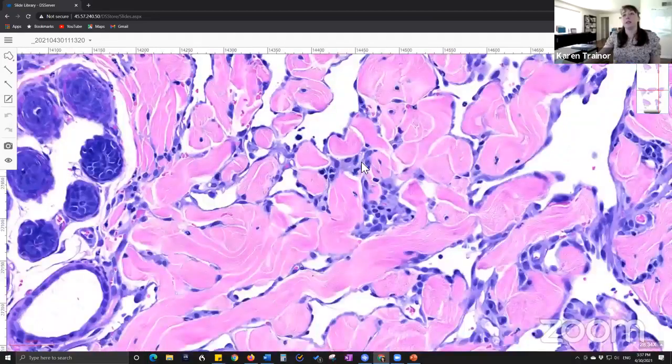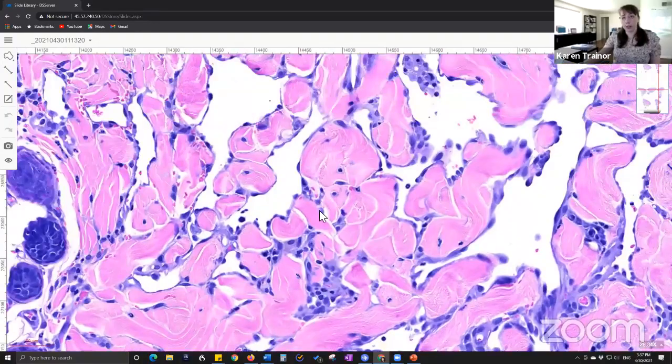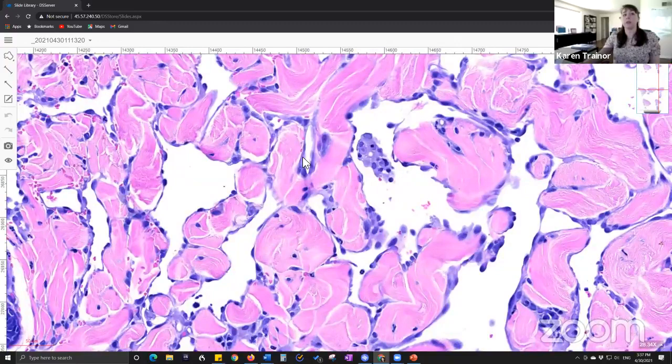And this particular entity is called ventral abdominal angiosarcoma, sort of splitting the difference between, well, is this from blood vessel origin, where there is a basement membrane intact beneath those endothelial cells, or is this from lymphatic cell origin, where there is no or inconsistent basement membrane beneath those endothelial cells?